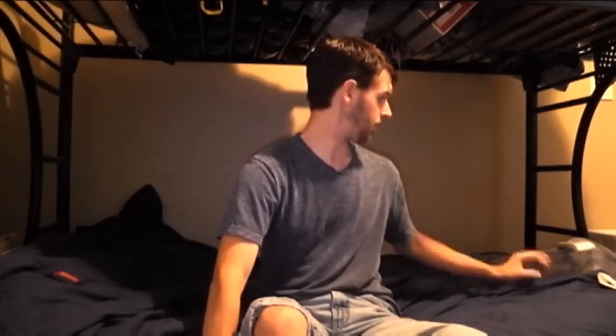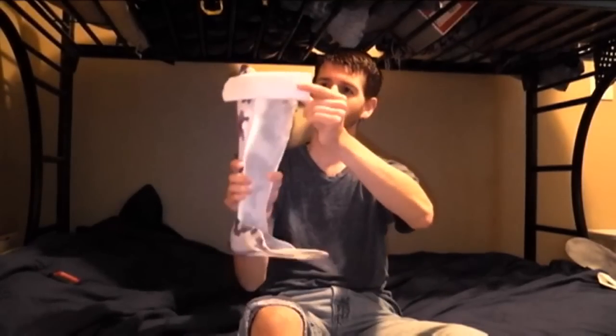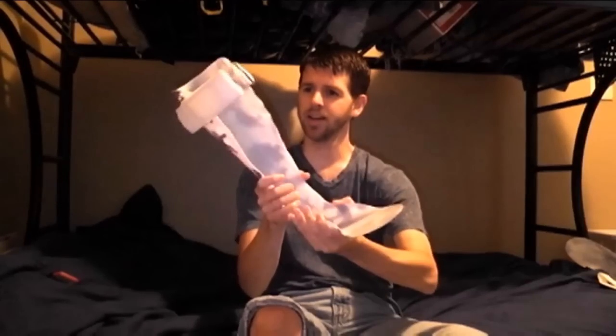I recently got some new leg braces because these ones were getting old — I've had them for like six or seven years. This is kind of the new ones I got, and as you can see it's more of a camo blue color. It still has all the same features: the strap to hold your leg in place and the foot part to hold your foot in place, but I kind of enjoyed the different color. I didn't know that they could do that, so I went ahead and ordered the camo blue. And that's pretty much what a leg brace is and how you would put it on.